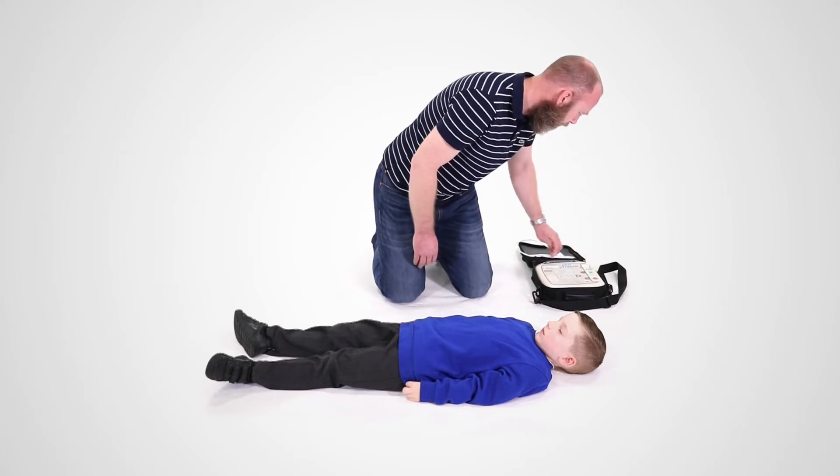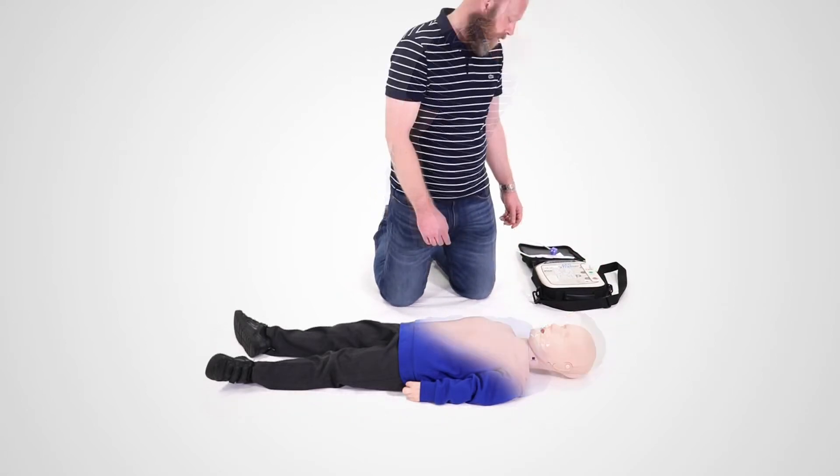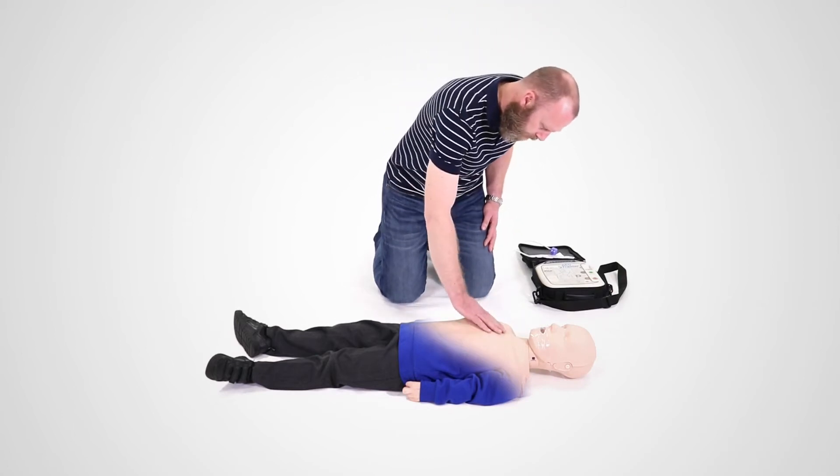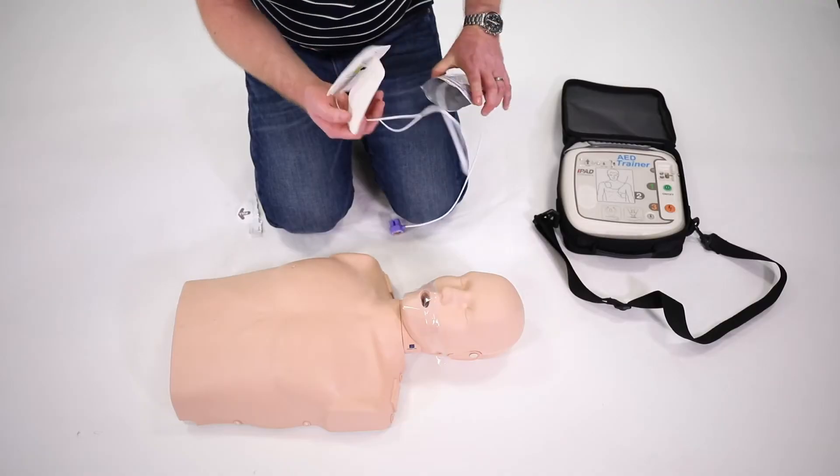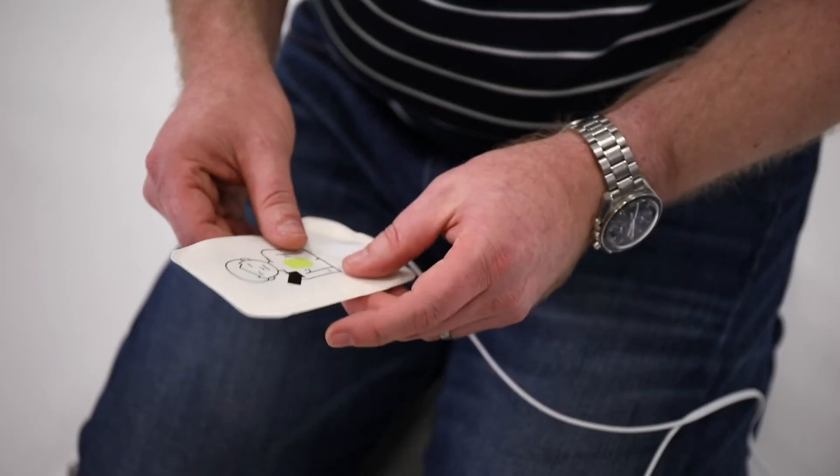Remove all clothing from the child or baby's chest. Make sure the skin is dry. Open the bag and take out the pads. Pictures on the pads will show you where they should go.